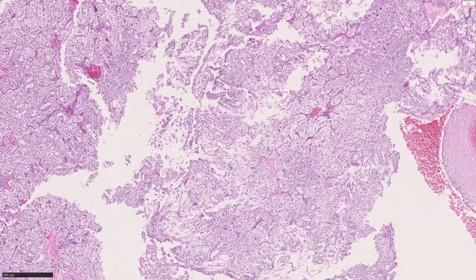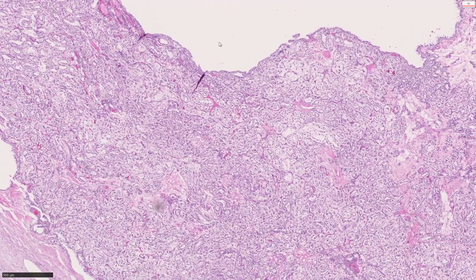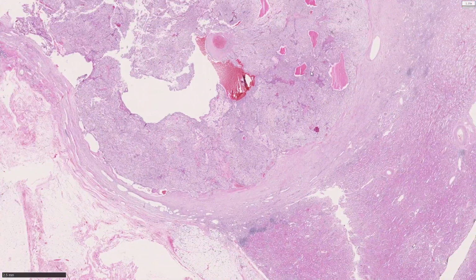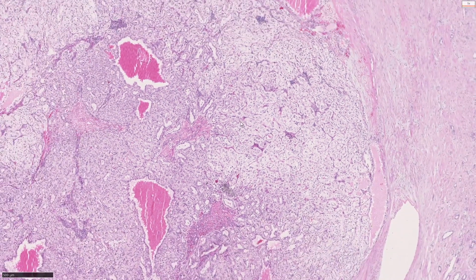To wrap it up, these tumors are not so uncommon, and the diagnosis is straightforward if you keep them in mind. You will need immunohistochemistry to support your diagnosis or impression. I like to keep it strict to avoid overcalling or miscalling other subtypes.